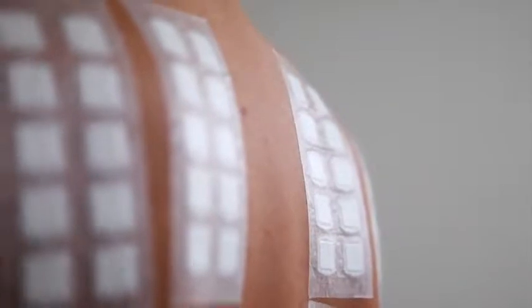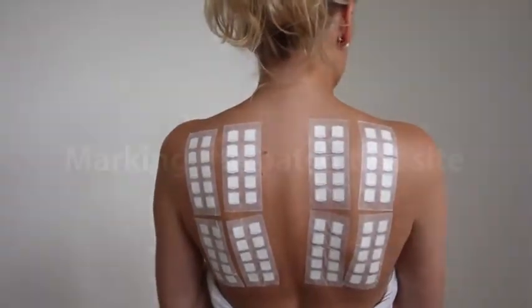If several test series are applied, two horizontal rows of 4 to 5 units per row can be applied across the back.